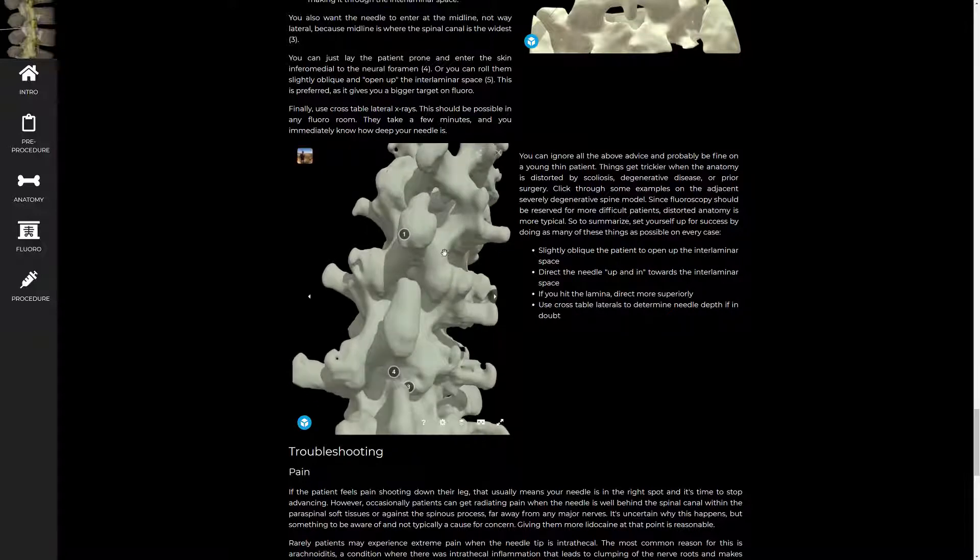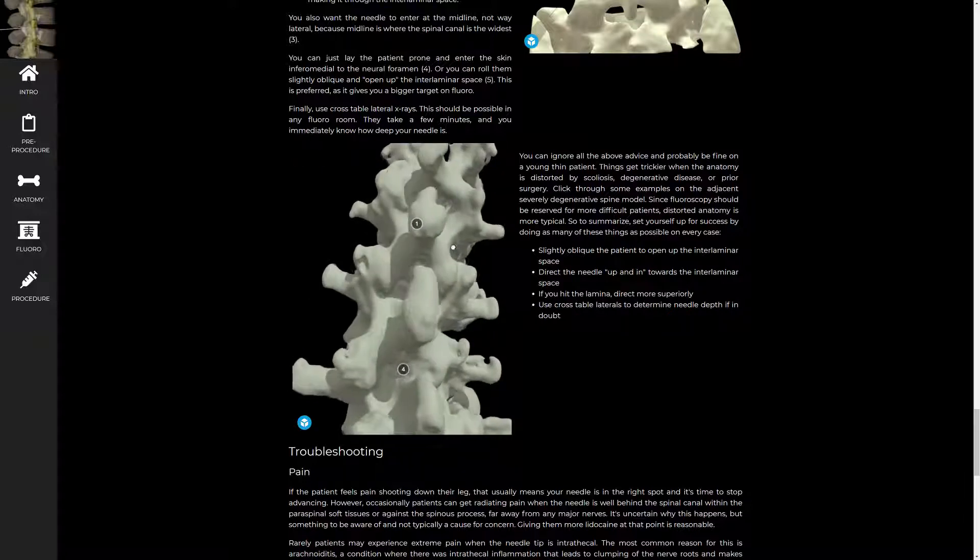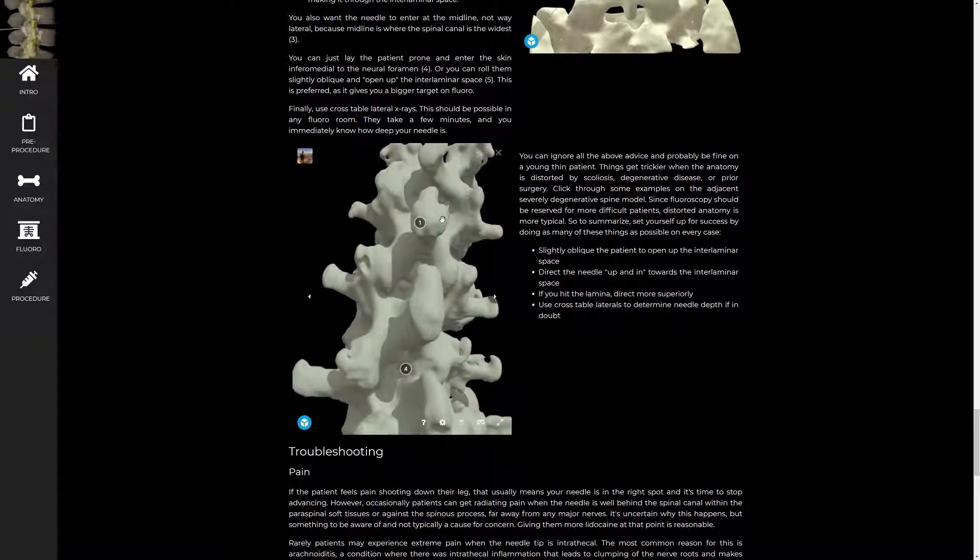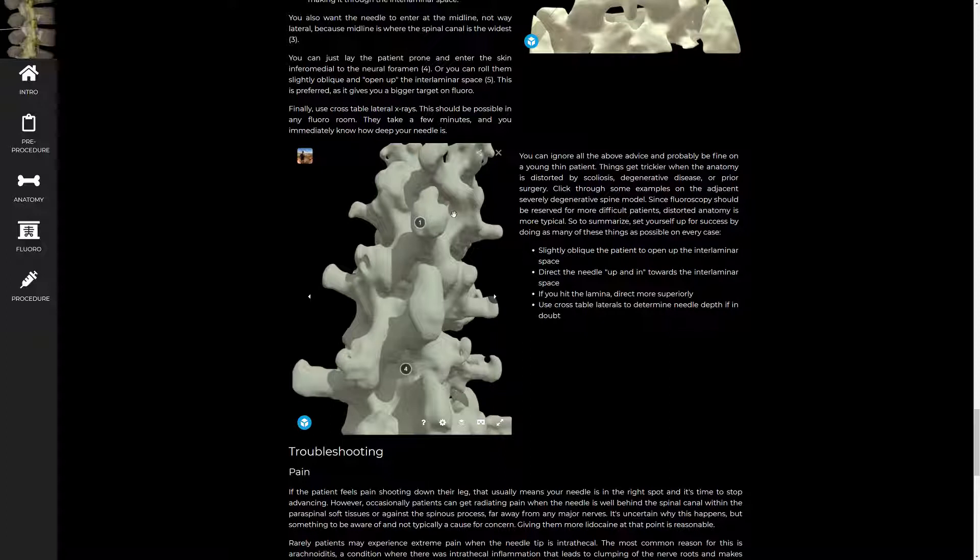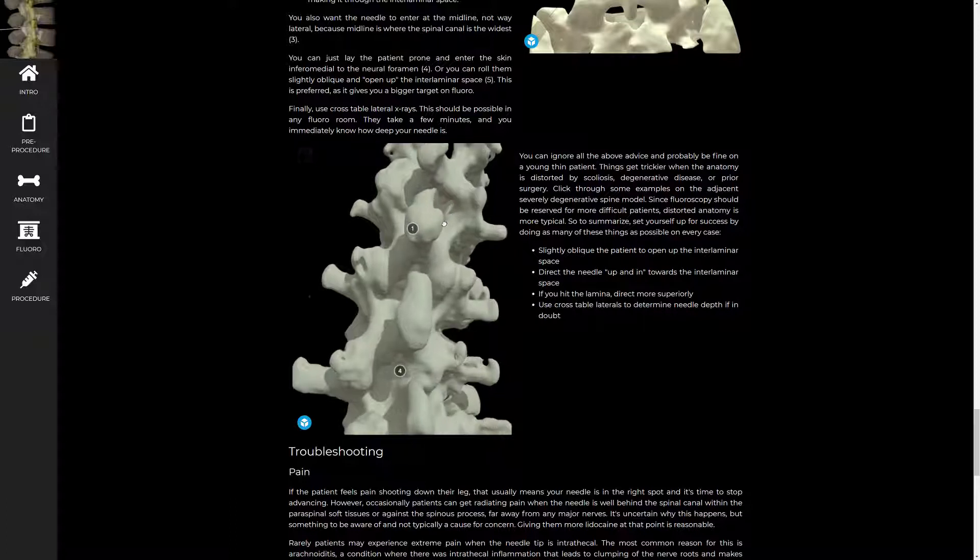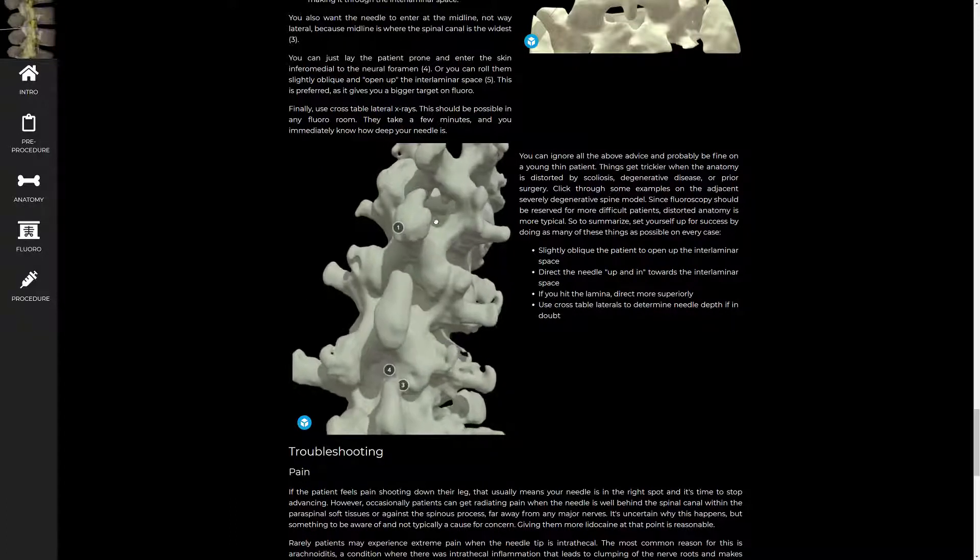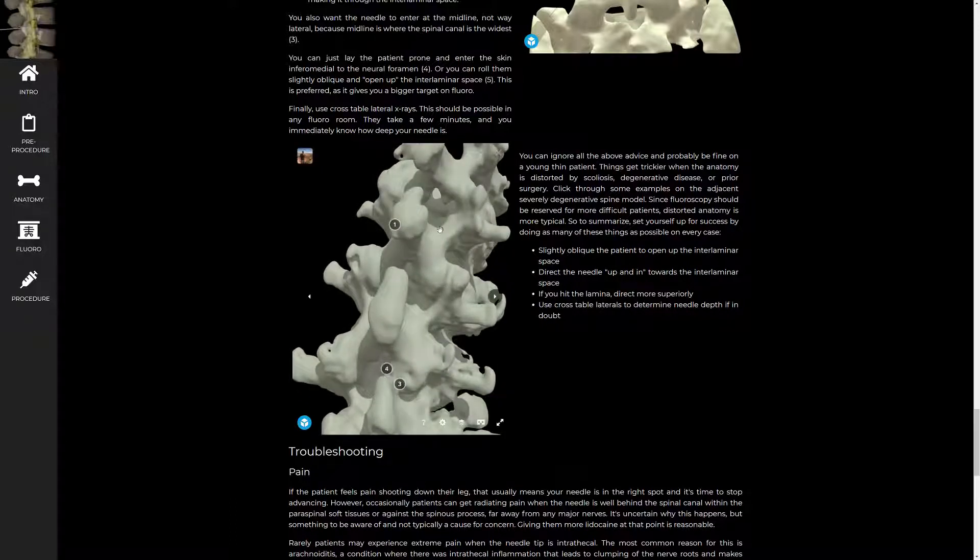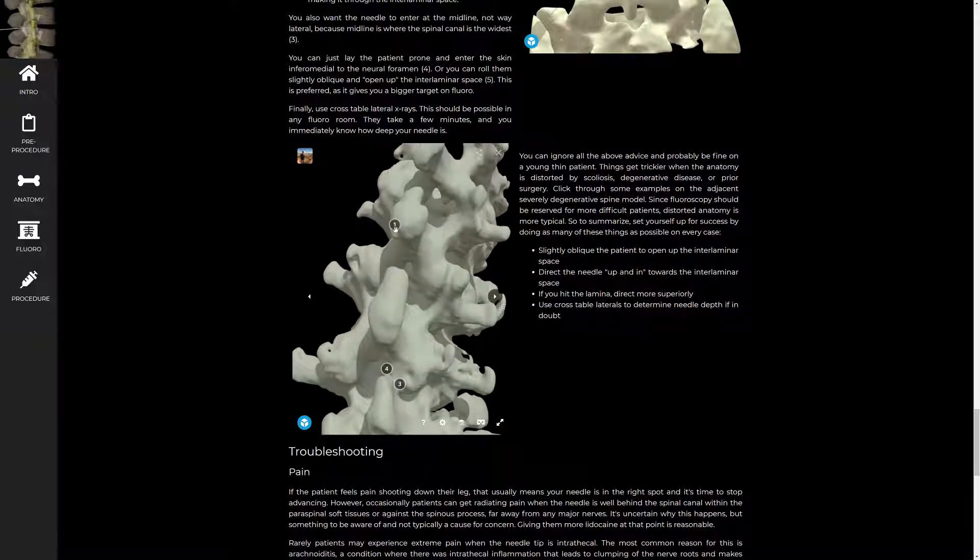So here's your interlaminar space here. You can imagine that if this is your needle approach and you hit this osteophyte, you're pretty much sunk because you'll try to direct laterally and then all of a sudden you'll see a needle well lateral to the interlaminar space and the spinal canal. So osteophytes can be tough to direct around, but if your needle is going this way, you'll avoid the osteophytes altogether and they're not a problem.